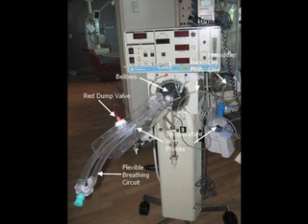Finally, I want to mention just a couple more things. Typically, at the beginning of oscillatory ventilation, a recruitment maneuver can be done, and you can read more about this in the Sensormedics 3100B Pocket Guide or in the book that I referenced earlier. Just be aware that a recruitment maneuver could lead to tension pneumothorax, and so you should be prepared for that possibility. Also, you should have the Sensormedics 3100B Operator's Manual handy, and you should be familiar with it.